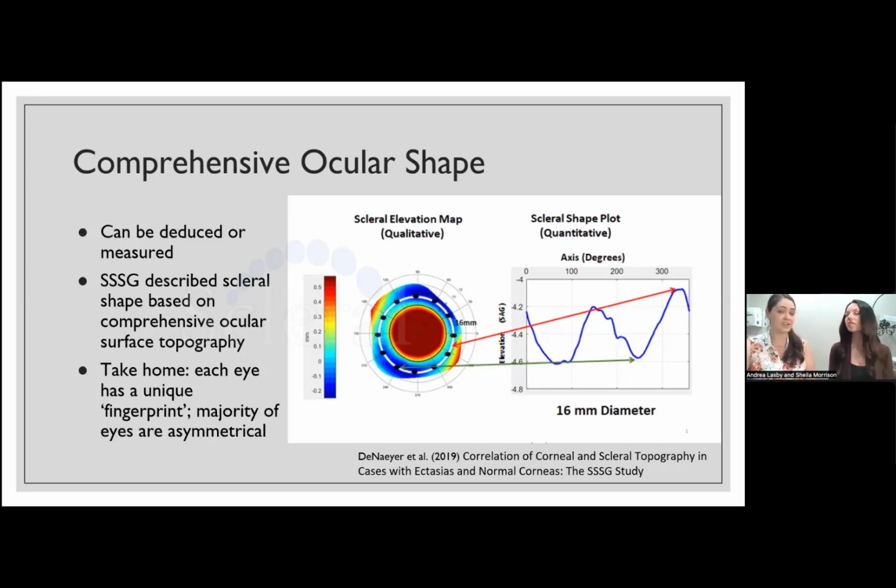And as more research comes out, I think it was Chad Rosen in 2015 who gave a talk and started to talk about how asymmetrical eyes were. And I was like, yes, I'm not crazy. We see a lot of asymmetrical eyes. So specifically torics, I start with them with every single lens. And sometimes I'll go back and be like, oh, this is weird, it's not fitting right. Let's go to spherical and it's better, which is great. But honestly, that's like 20% of my patients now. Yeah, I would say more in toric.